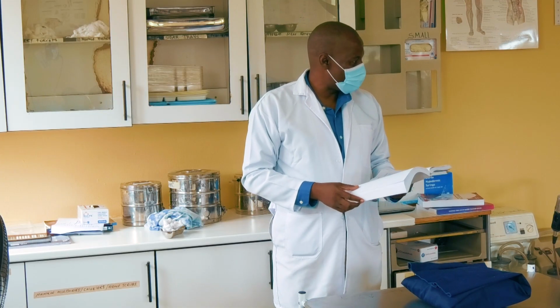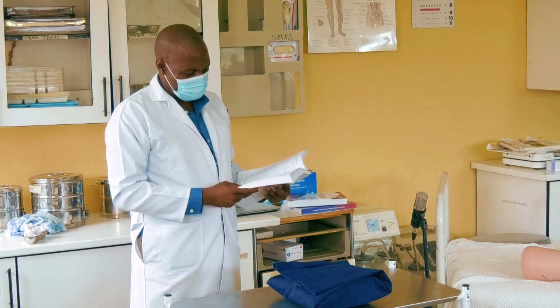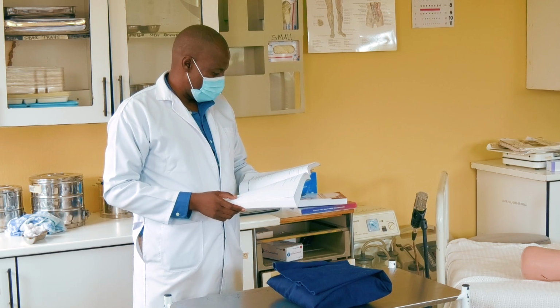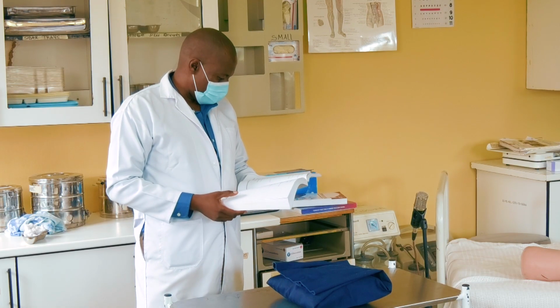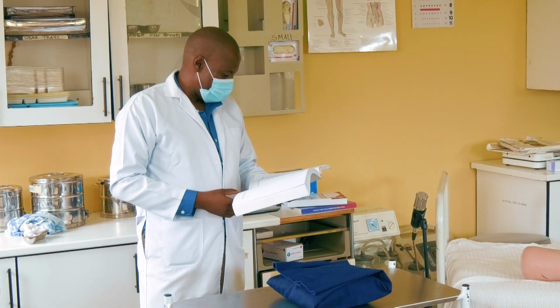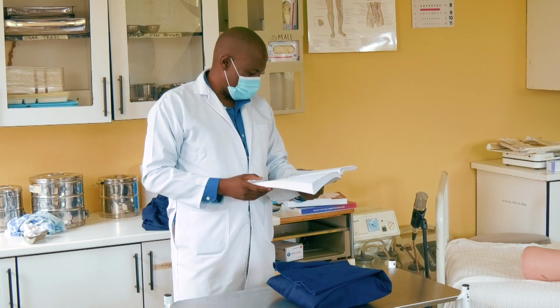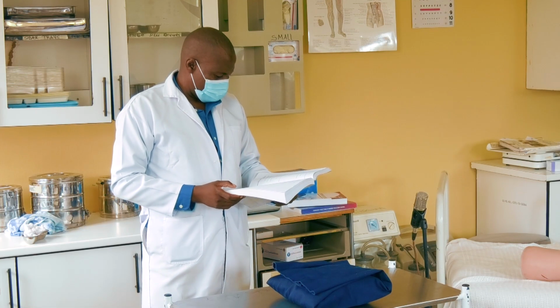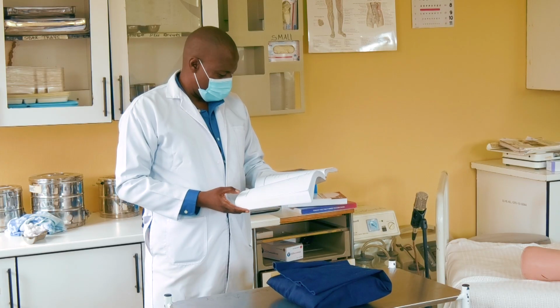So, good morning once again, class. Today we are going to demonstrate how wound suturing is done. We also call this one simple suturing. I'll go through the procedure manual briefly. The definition of wound suturing is a stitch or series of stitches used to close a cut or a wound.